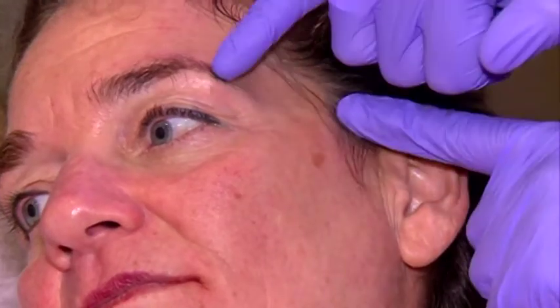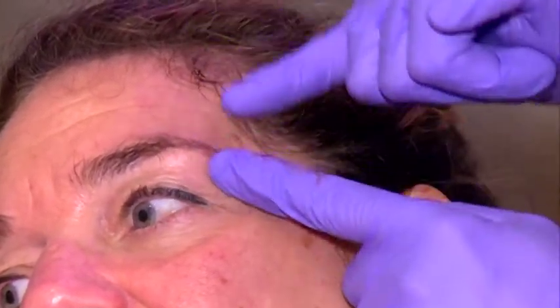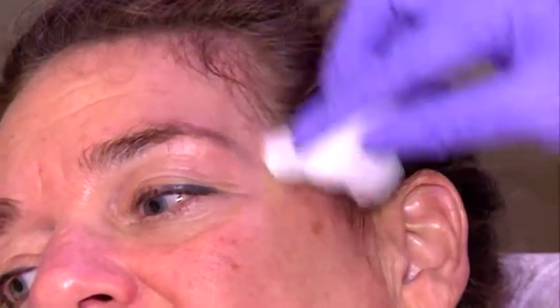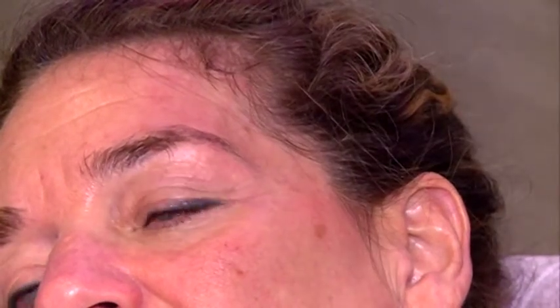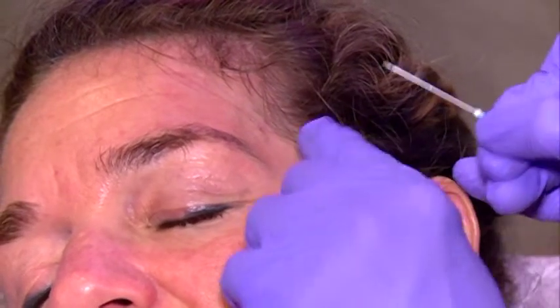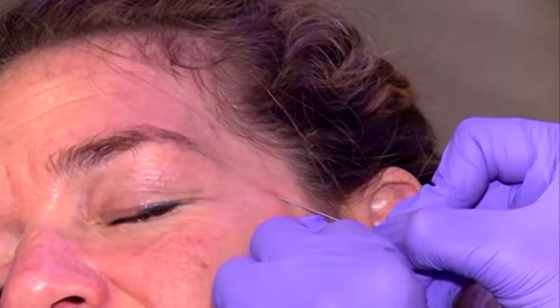Sorry, turn the head like this. Once more, anatomy. The border here is the temporal fusion line, crista temporalis, orbital rim here, zygomatic arch. I disinfect once more. You have some irregularities in the skin, which is not a problem at all. When the patient sleeps, tomorrow when she wakes up, everything will be gone. So here, little prick, superficial, almost parallel.